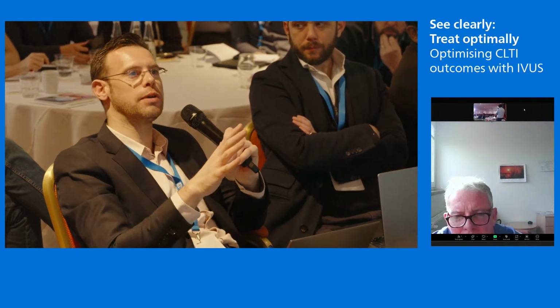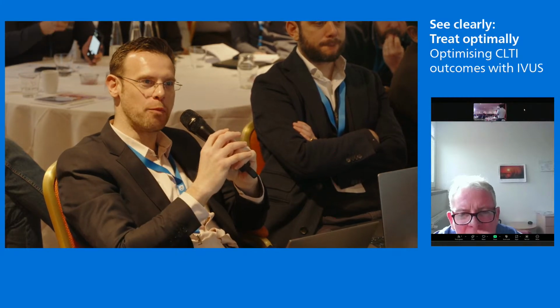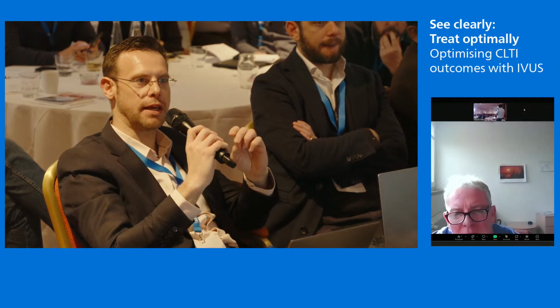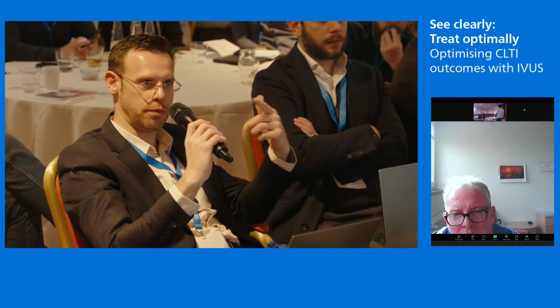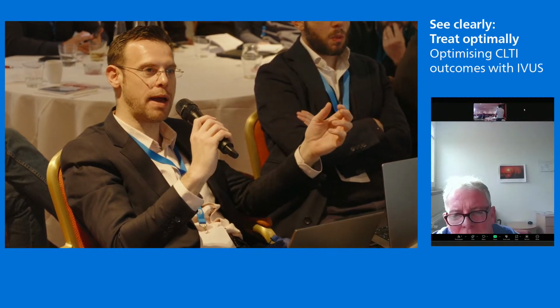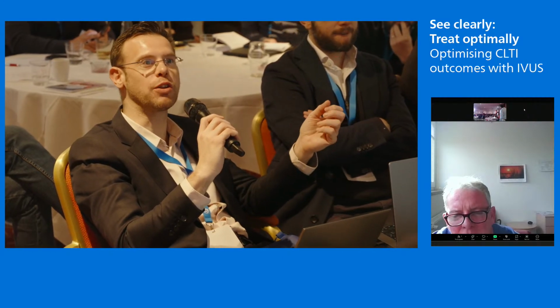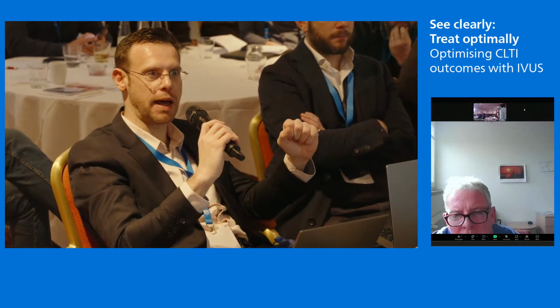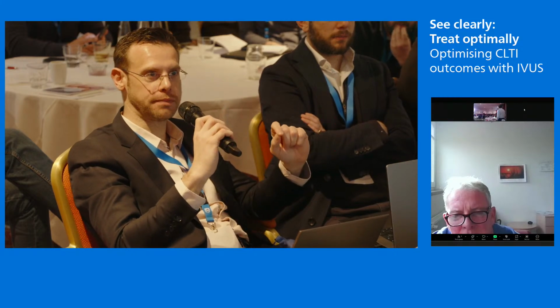But it's all to do with the angle of the bifurcation and it being not too calcified and rigid, because when there is some play, anything that straightens with a stiff wire, generally speaking, I think I've got away with. And I generally in those situations don't go a size bigger for the sheath. I'll go sheath size matched, and even then, I'm putting a pressure bag on, which I generally recommend when you use Rotarex, whether it's antegrade or retrograde. It's part of my practice to do that, and it will be through the 8 French sheath, just with the pressure bag on. So no, I haven't had too many problems, as I say, until I did, and it was all to do with the angle.